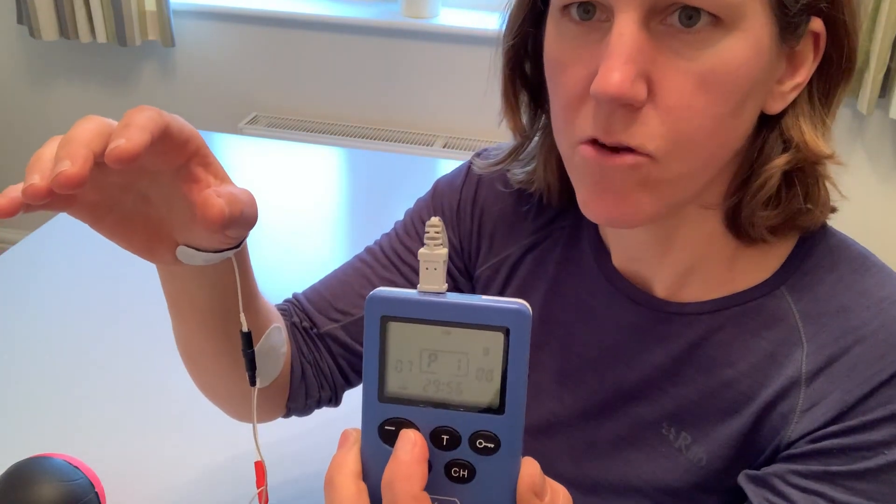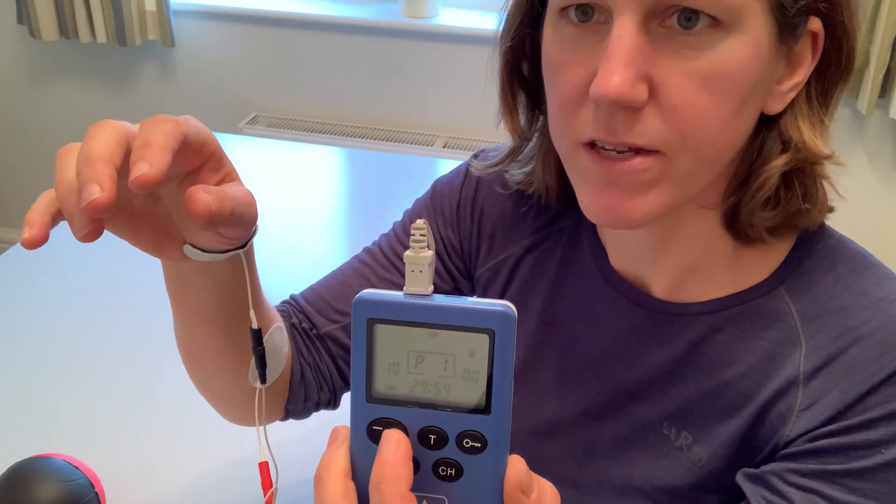I'm using our SABO stim pro. I've turned it on and I'm going to go with program one, which is a typical setup for muscle strengthening. To press go I'm going to press the channel button so the A is flashing, with the lead in channel A, and then I'm going to turn it up — and hopefully you'll start to see my fingers curling in and my thumb coming in as well, so it's now grasping.